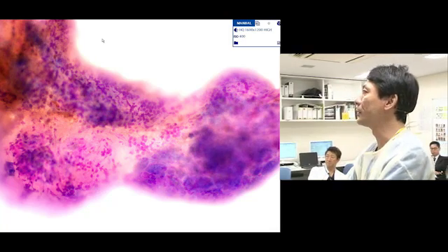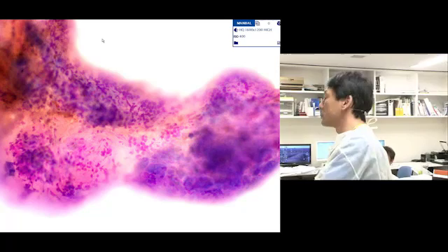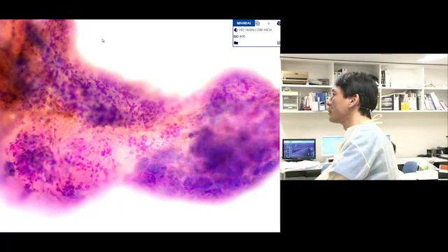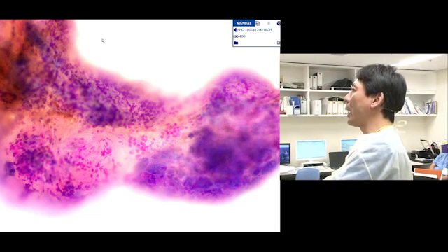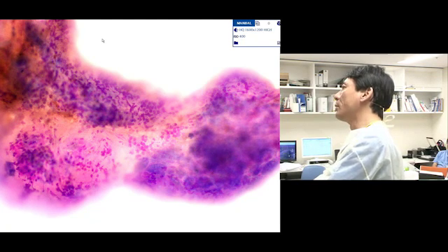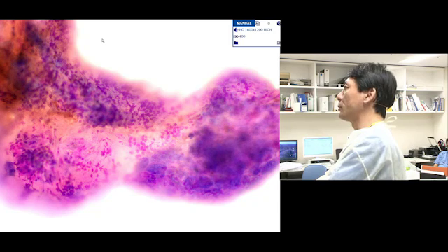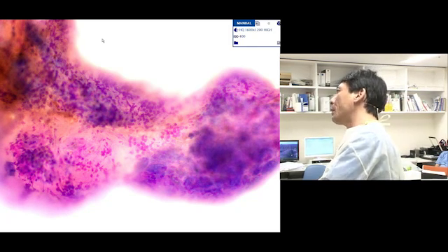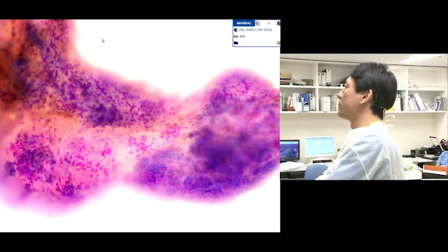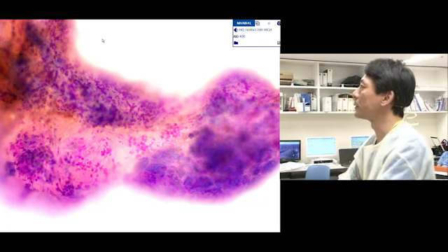Do you think the cell is enough for the pathology examination? I think so. As you can see, there are not stromal cells, not spindle cells, but epithelial component, cell components. Well, thank you very much for the beautiful specimen.